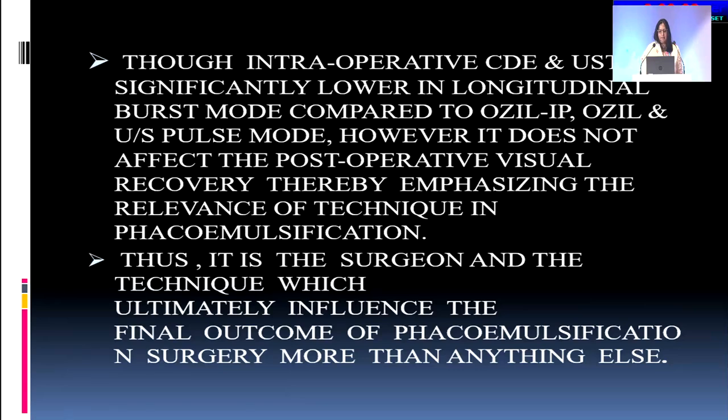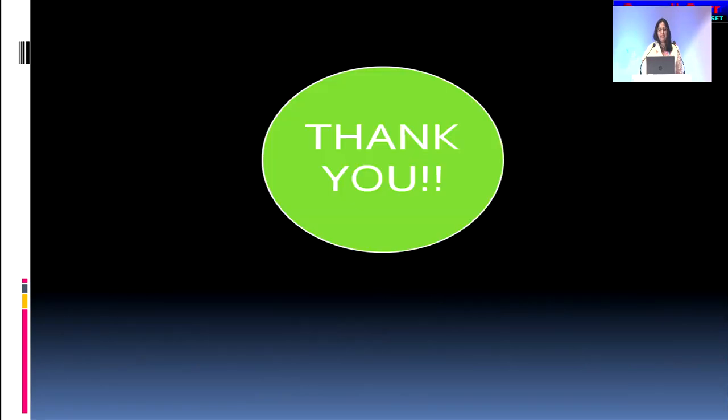So though intraoperatively CDE and ultrasound time is significantly lower in the burst mode compared to other modes, it does not affect the postoperative visual recovery, thereby emphasizing the relevance of the technique in phacoemulsification. Thus, it is the surgeon and the technique which ultimately influence the final outcome of phaco surgery rather than anything else. Thank you.